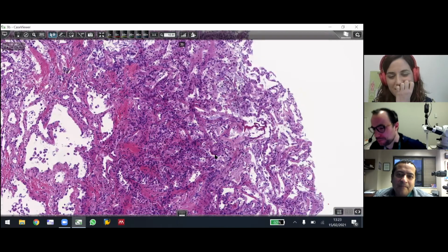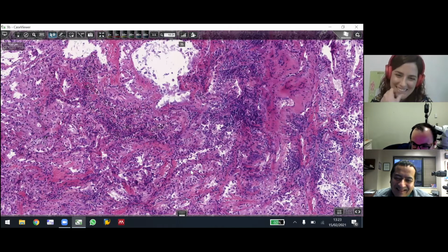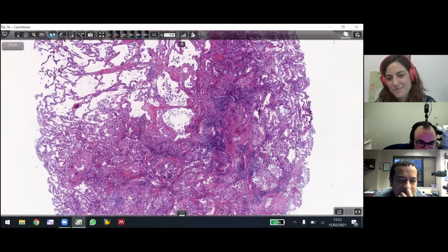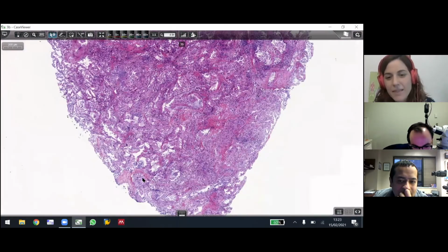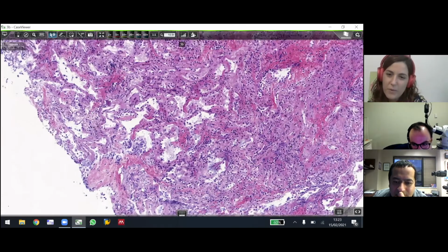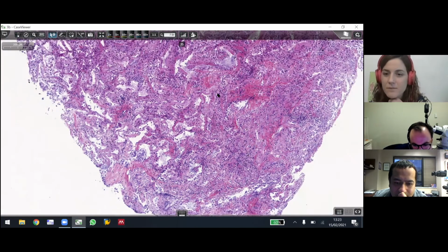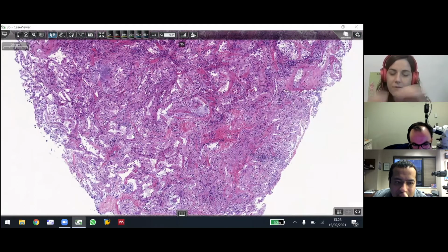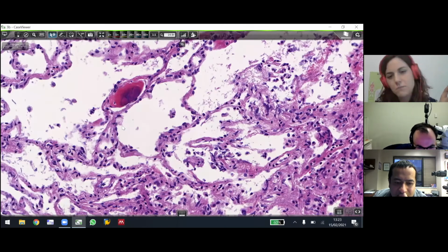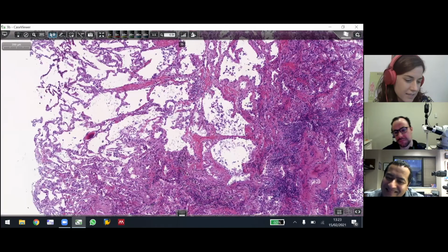Whether that's just really old OP. That's my idea. Is this more like the aged OP, or cicatricial? Yes, that's what I meant. This is a very old OP. I don't want to call it OP, but I think it's a very old OP. From the shape it takes, I think there are Masson bodies here. You see one ossified. Yeah. And from the shape, and I'll tell you the story.